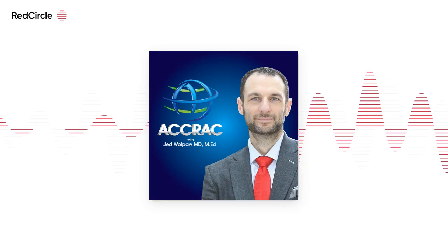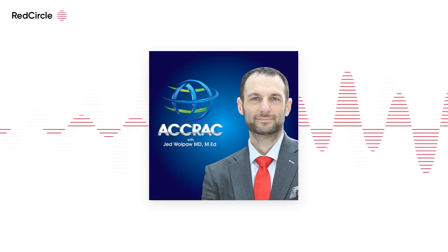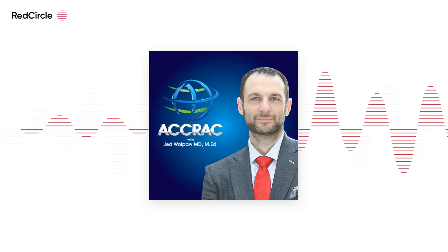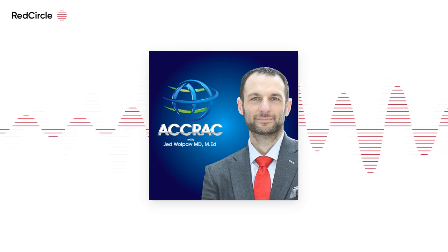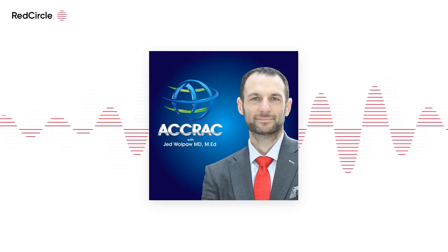You're stretching out those alveoli. So presumably, and this is like Tom said, an imaginary point, but we like to think there's some amount of pressure where you keep as much of the lung inflated as possible without overinflating it, and therefore minimize injury and optimize oxygenation. Great. Tom?